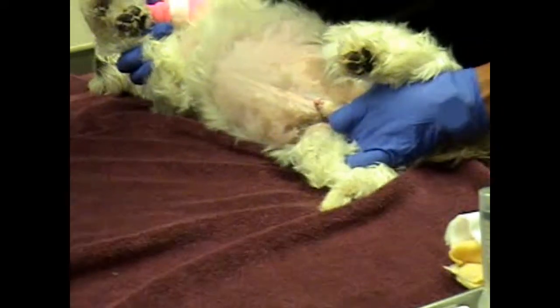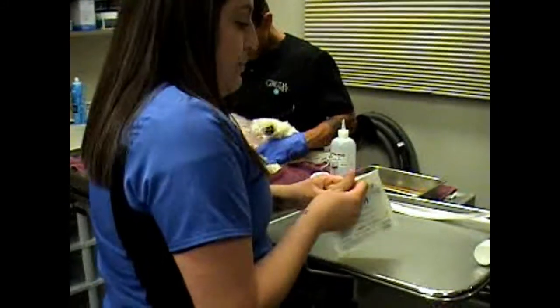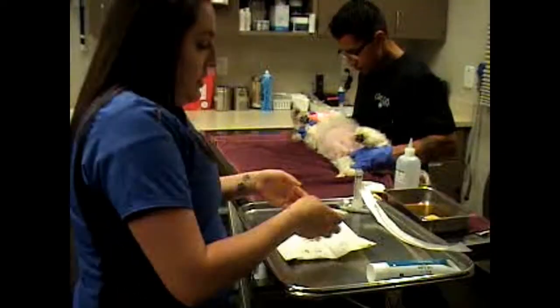Okay, so what I'll do is I'm going to put on some sterile gloves. That way everything is kept really sterilely and we won't have to worry about any bacterial interference with the urine sample.